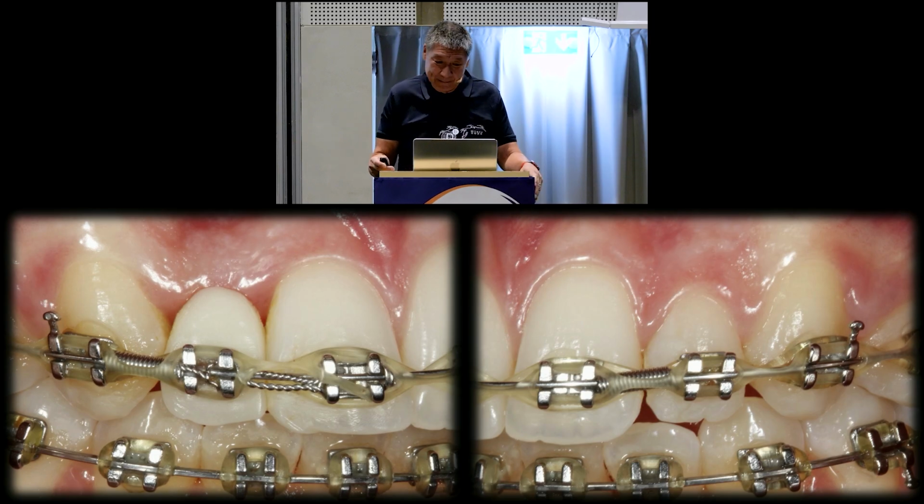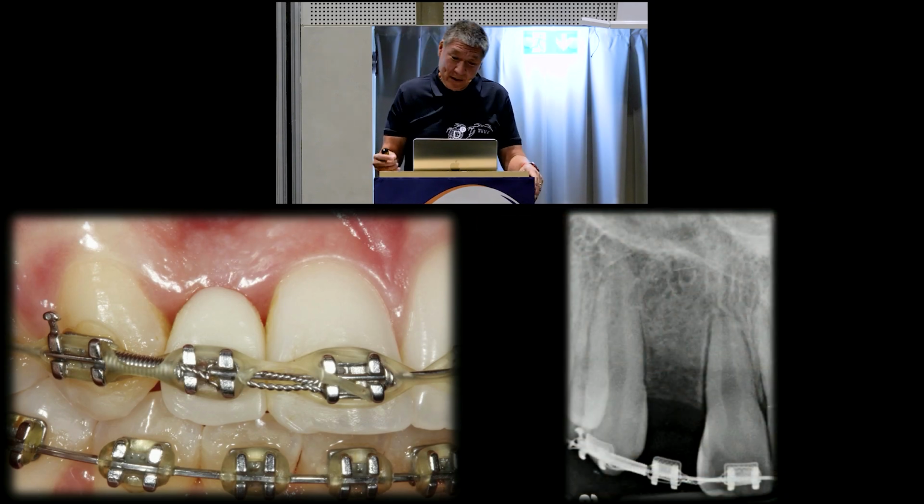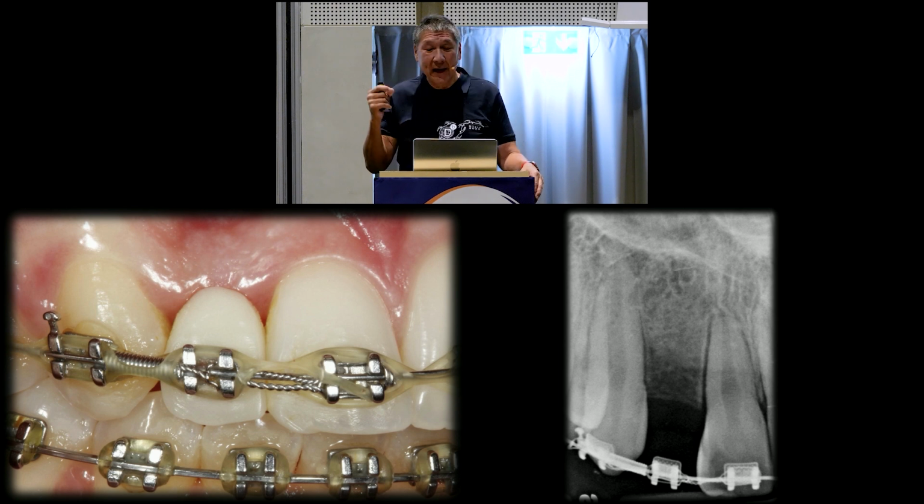It's just that simple. And that's how I would try to sequence these types of patients. Once her case is set up, the dentist goes, okay, now I know how much space I have, and now I can figure out what width of an implant I should use.